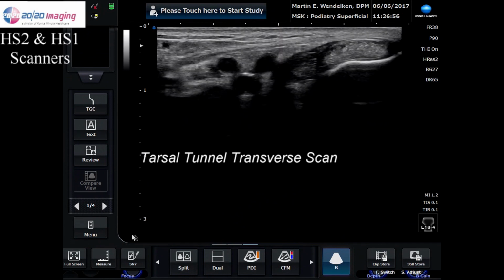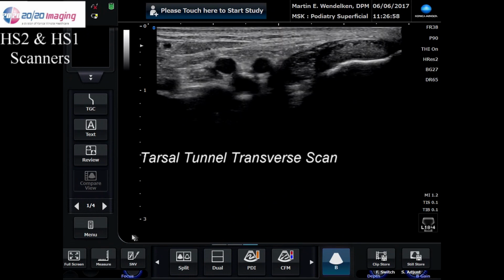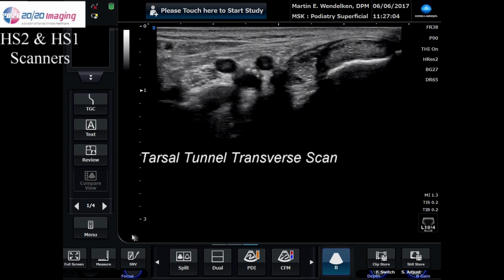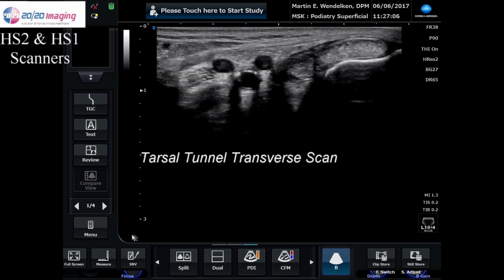Okay, let's now move on to the medial aspect of the ankle, and we're going to demonstrate the tarsal tunnel. In this view, you can see the two tendons, the artery, vein, and the posterior tibial nerve, and even the laciniate ligament, the flexor retinaculum.